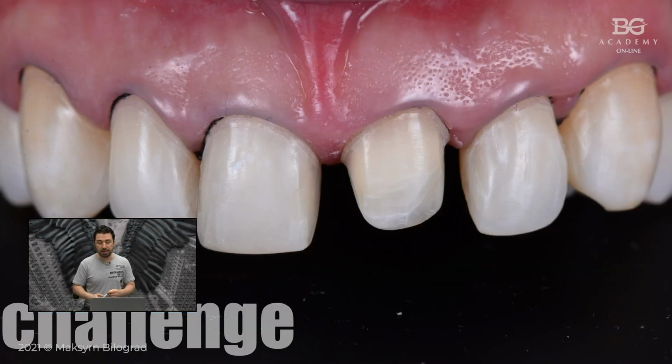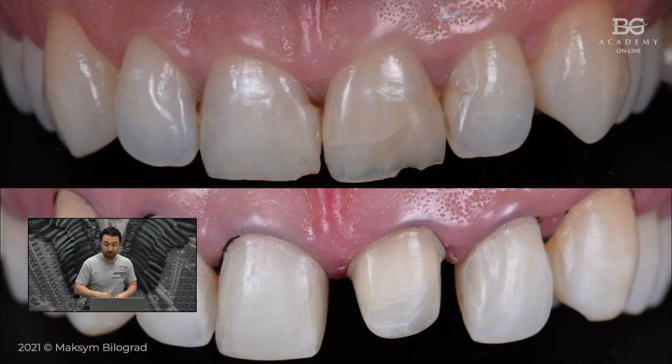And here you can see straight after preparation all of these teeth, no dentin was exposed. All preparations were done in a very conservative way, even with these canines that I was afraid of at the very beginning. The patient was not anesthetized when I was preparing his canines.